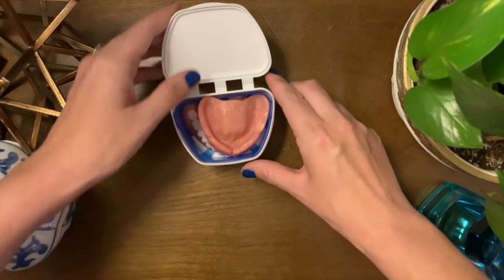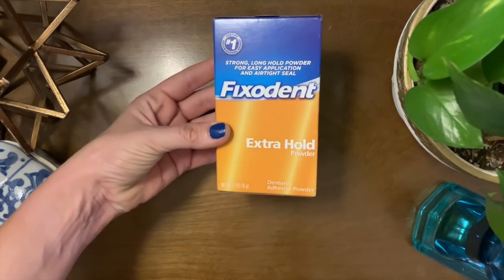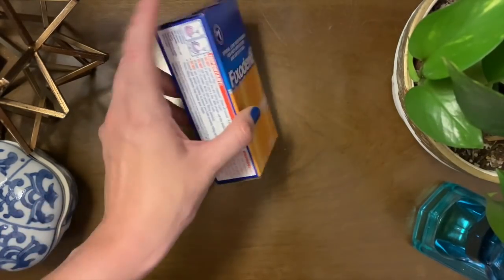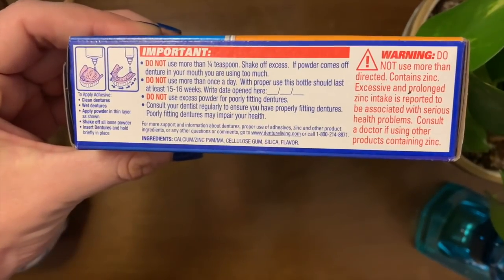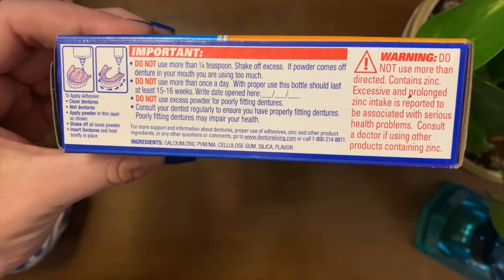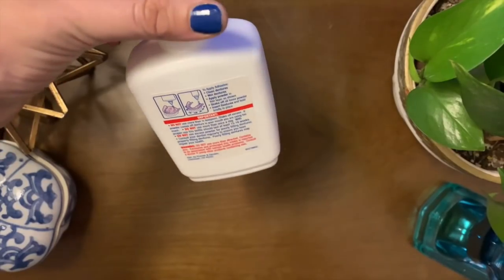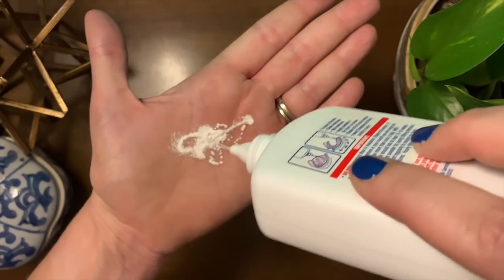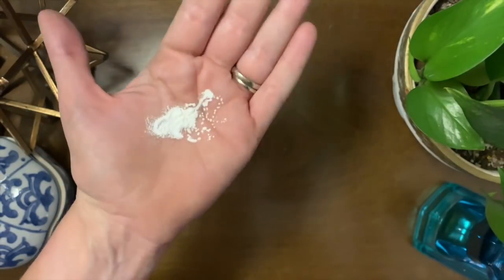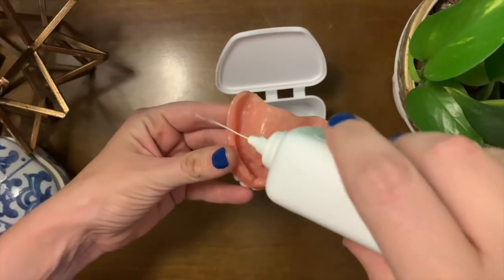The next thing that I got was some Fixodent Extra Hold Powder Adhesive. This is really the only adhesive that I used. I tried the paste and I didn't like the way that it felt — it felt kind of squishy. The powder is really nice, and I swear this bottle will last you forever. There's so much product in here because you really only need to use a tiny bit to secure your dentures.